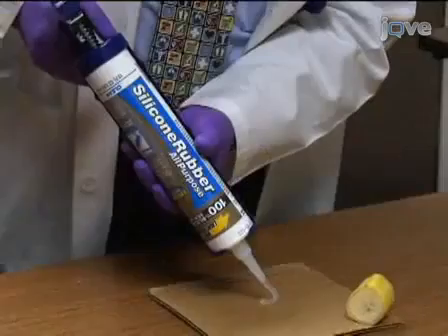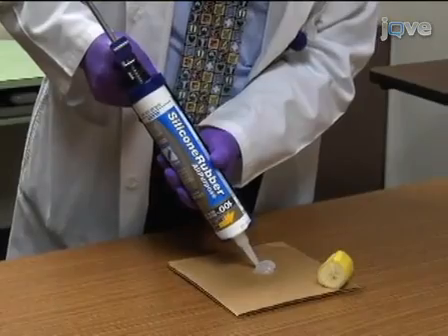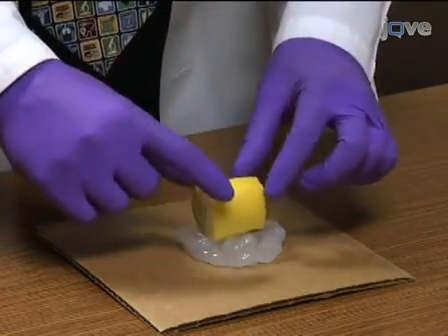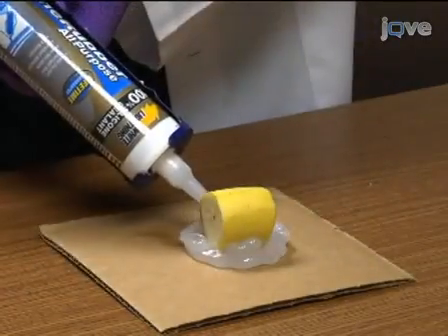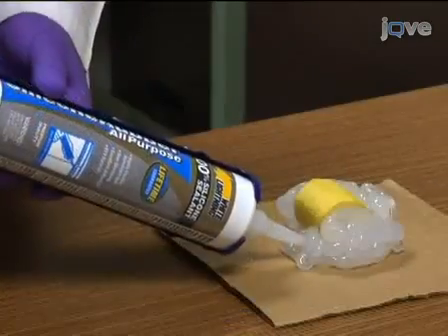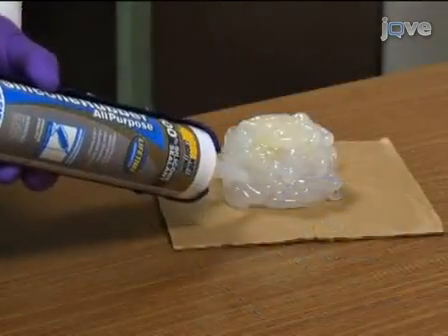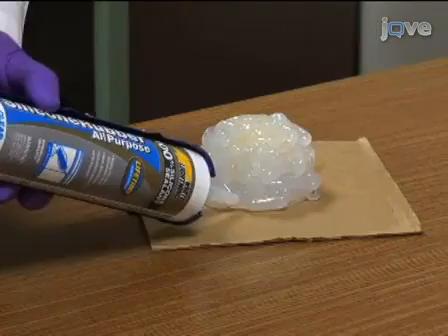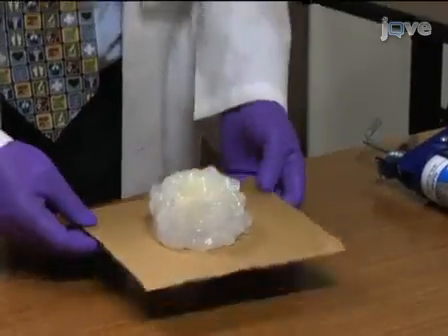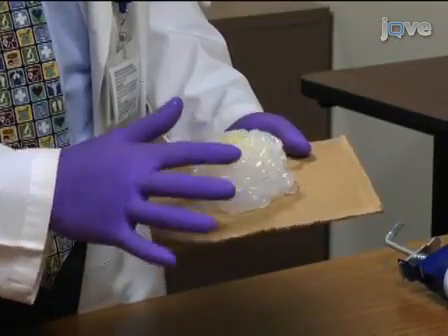After the phantom lesion core is ready, take a caulking gun and spread about a 1/2 inch thick layer of caulk onto the base plate. Lightly press the phantom lesion core into the wet caulk. Now add more caulk over the phantom lesion core to completely embed it. Be careful not to trap air bubbles in the caulk. Wearing gloves, spread the caulk over the phantom lesion core by hand to make sure it is completely surrounded.